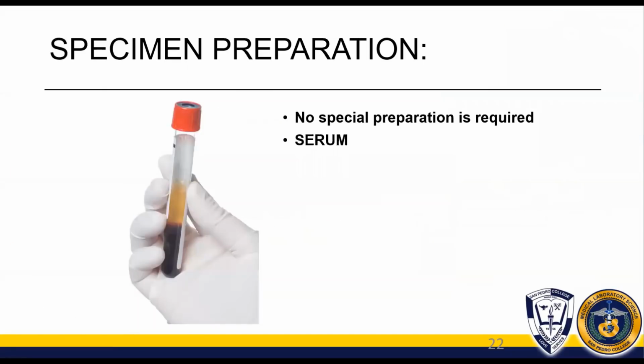Okay, question. Ma'am, can we use plasma instead of serum? Yes, class. You may use plasma naman, but serum is recommended kasi less problematic ang testing with serum than with plasma. There are cases kasi that the antibody level is lower in plasma than in serum. This is probably because of the interference caused by the use of anticoagulants.